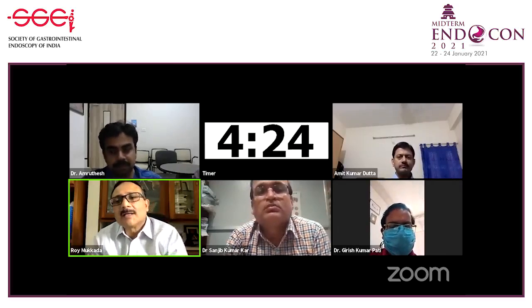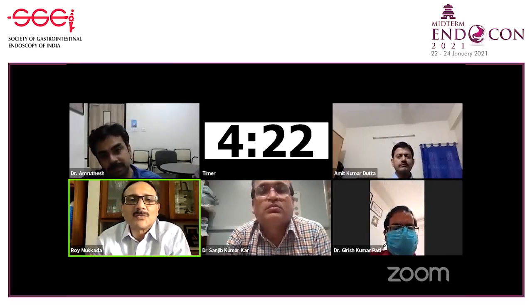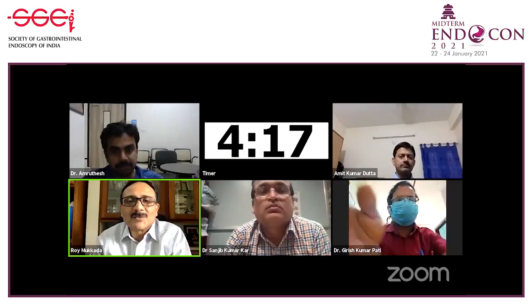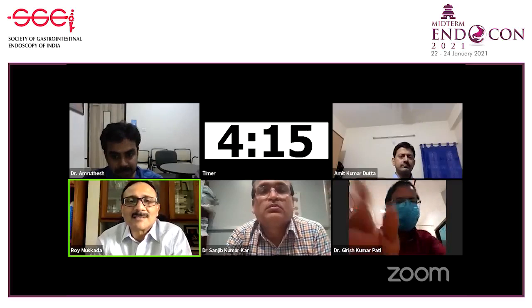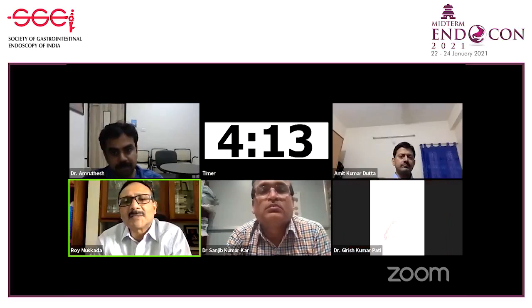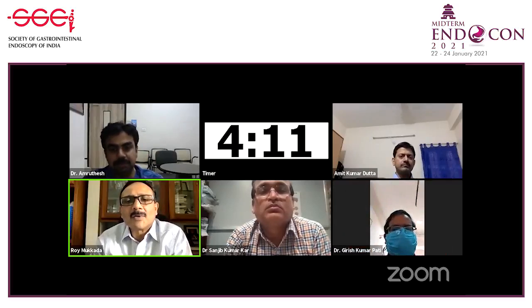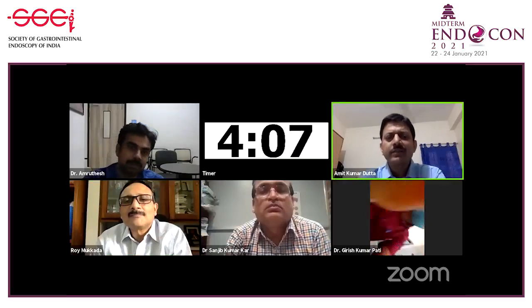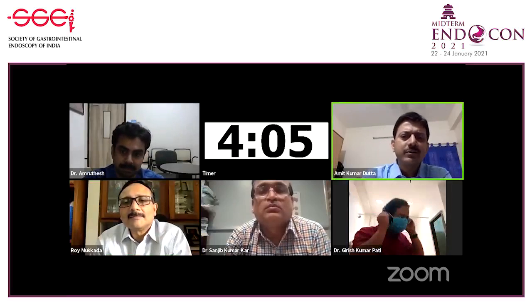With ESD also, it is always better to have some close follow-up, because in case we miss something, somewhere a recurrence may be happening. It's better to have a 6 monthly to yearly follow-up. I would like to have Amit's opinion also here. Yeah, so I think the first one after 6 months, and then probably annually is what we do actually.